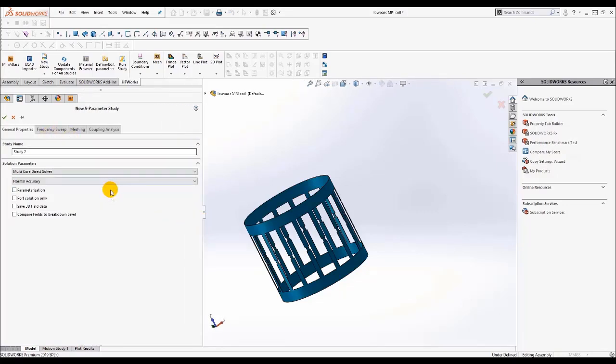We have some properties to set for our study. So we start with general properties. We have the name, and here the solver type: many solver types, the direct solver, the iterative solver, etc. We have the accuracy solver type, normal and high accuracy. We have some options like creating a study with parameterization. Also, you can check only the port solution or also the 3D field data, etc.